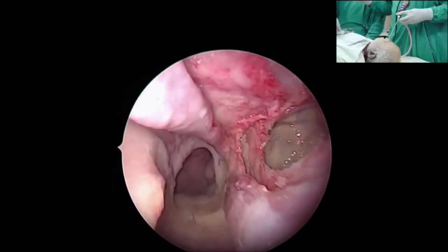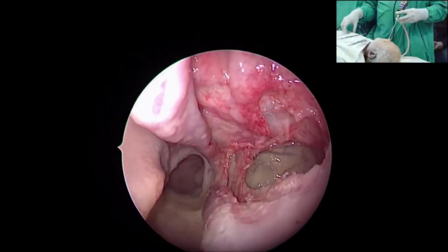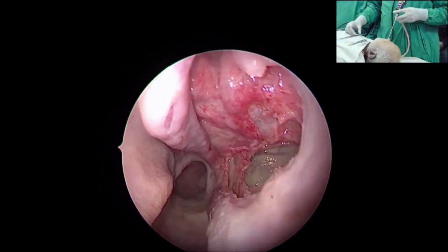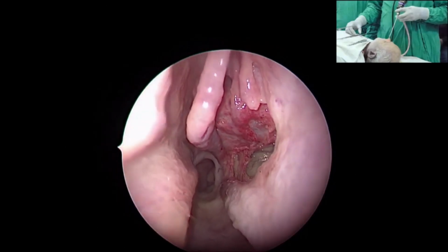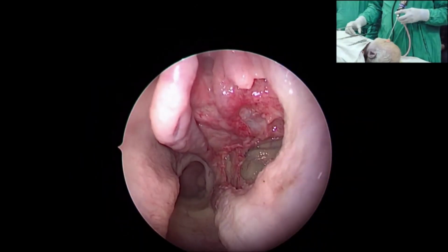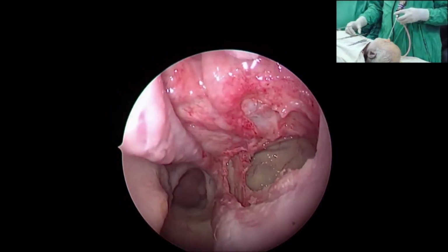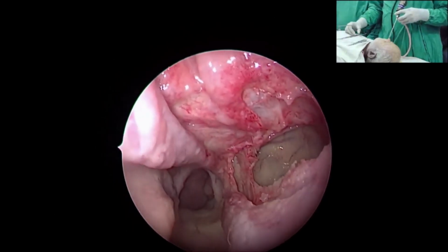Local blocks, I told you during live surgery, in any nasal or skull-base procedures, we are not infiltrating at all. We are solely relying on the pre-operative preparation, intraoperative preparation, including topical saline adrenaline, and the anesthesia help from the anesthetist by reducing the cardiac output and the heart rate.